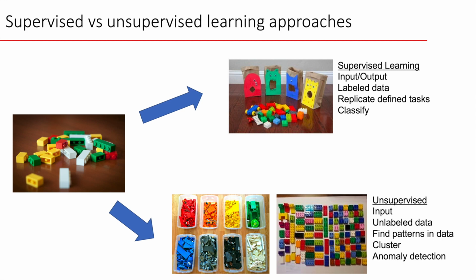But I think the most exciting part is that one child may decide to group the pieces based on color, while another child may decide to group them based on shape. And so it leaves open an opportunity for discovery and anomaly detection. If there was an irregularity in the data that was unanticipated, these types of approaches are much better at detecting these sorts of anomalies and highlighting them to both the parent or guardian, or also the clinician.